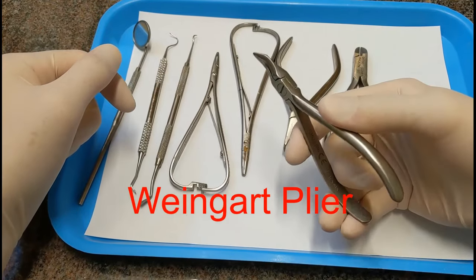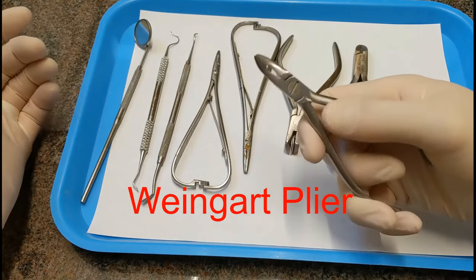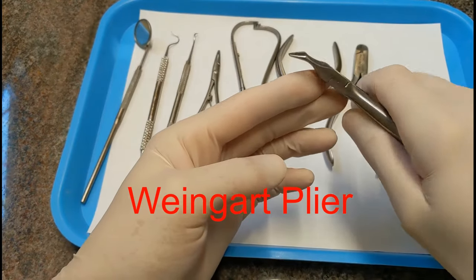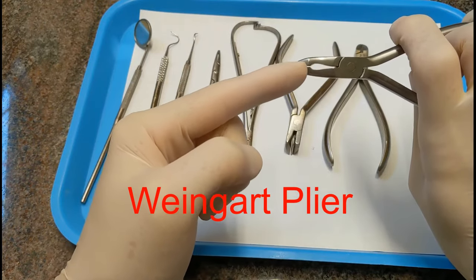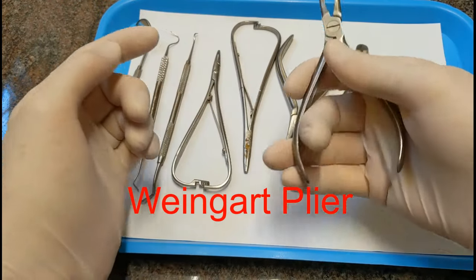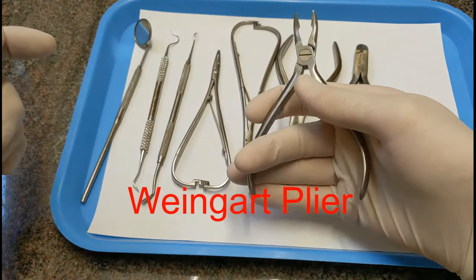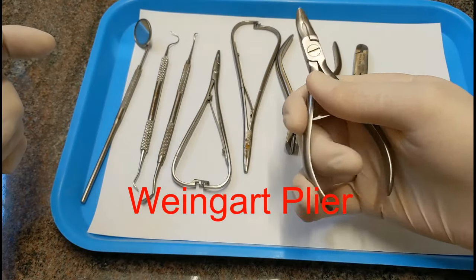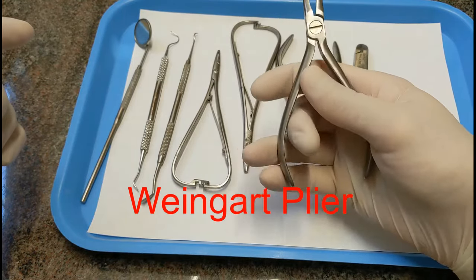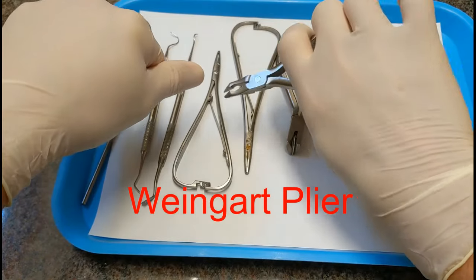This is called a Weingart plier — your basic utility plier for putting arch wires in the mouth or taking arch wires out. They come in several different shapes and orientations, but they're all called Weingart pliers if they're meant as a multi-purpose grabbing plier. For holding these — and this goes for all instruments — you want to be able to open and close it with one hand, because usually you're holding something with one hand and working with the plier with the other.